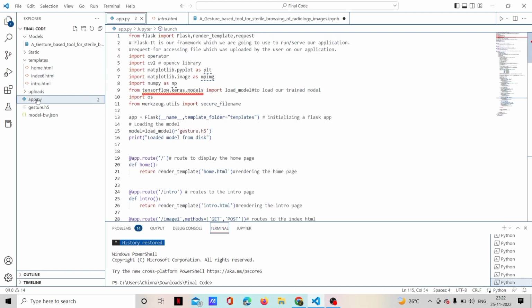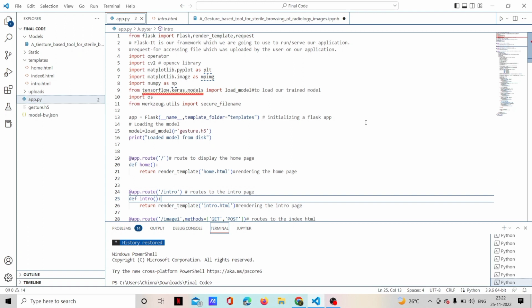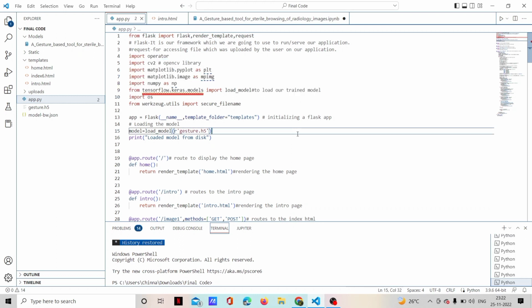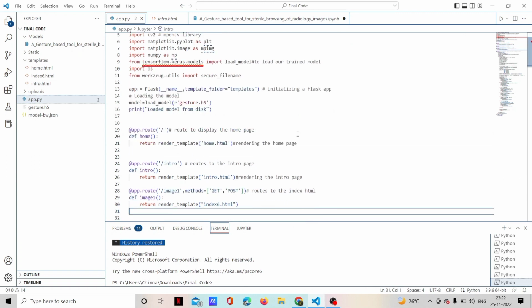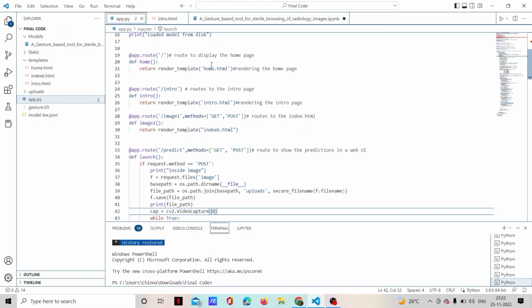Then the final step for creating the application is the Flask program, app.py. We use the Flask framework to connect our model and the HTML pages to form a web application. In this program, we have imported libraries like CV2, which is an OpenCV library, then again matplotlib, Tensorflow, NumPy, etc. Then the HTML programs for the home page, the introduction page, and the launch page are loaded.